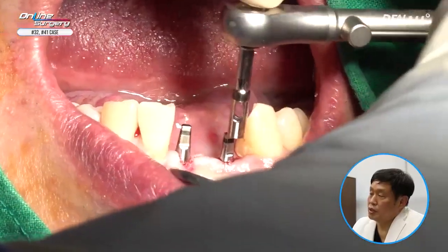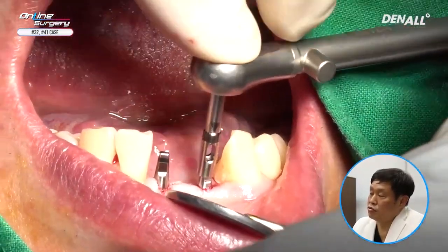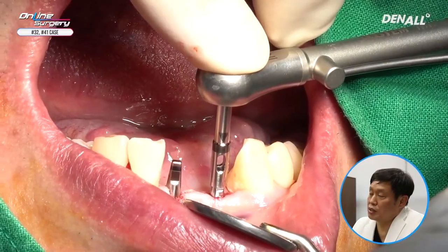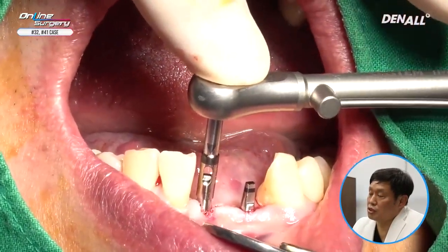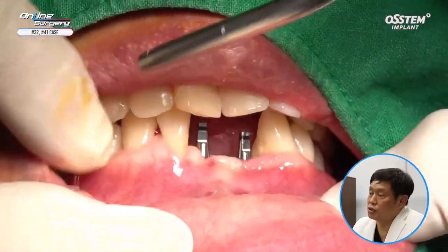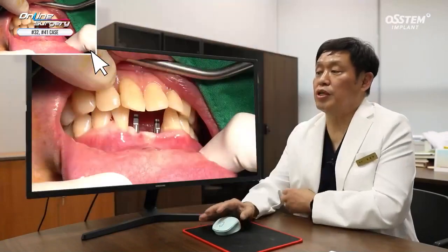Because I knew the position on CT ahead of time, I made slight alterations using my hand as I closely observed it. In the case of the MS implant, it is a one-body implant and we need to secure ideal space for prosthesis. This is in occlusion. You can see that the implants are placed in desired positions, and this was how surgery was closed.